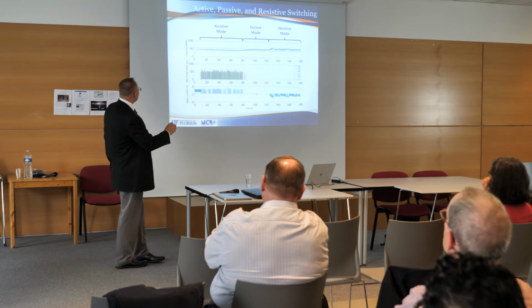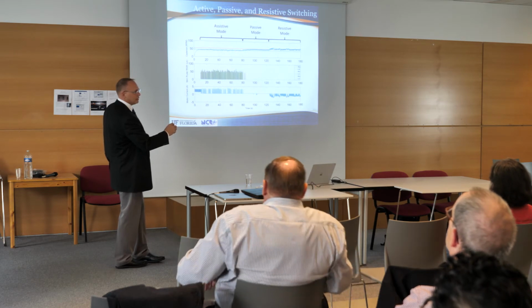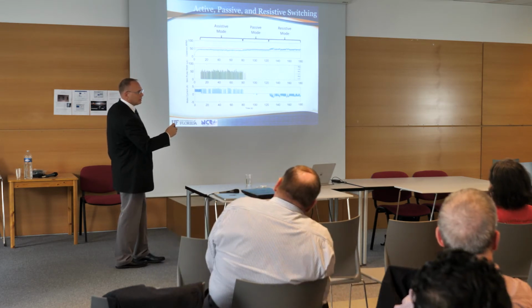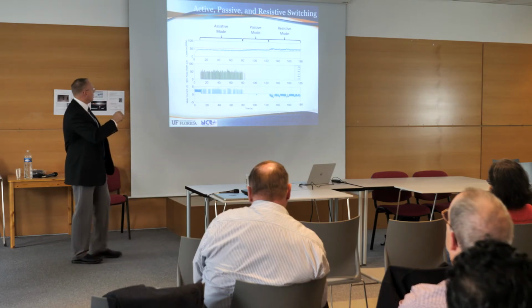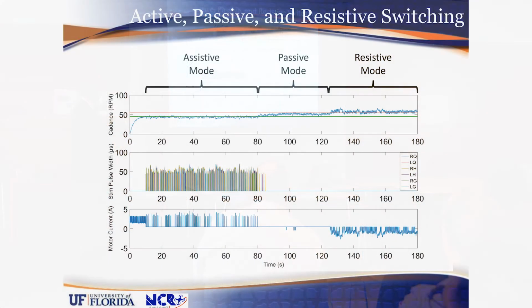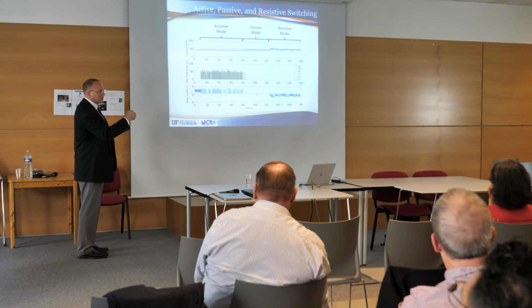So you're talking about this wiggle around 50? More or less. If you ask your patient to start pedaling a little bit to get everything into motion, and then you ask him, okay, now be passive, your stimulation should try to keep it up to 50, right? Even if he is relaxing and not doing anything at all. So, again, this was a staged experiment where during this period we asked the person to try not to pedal a little slow. But the stimulation should increase the speed then, right?